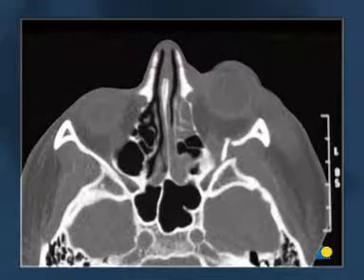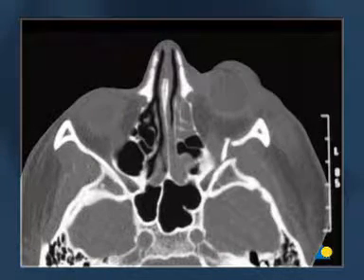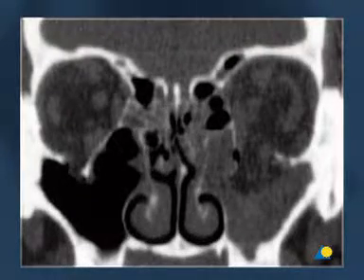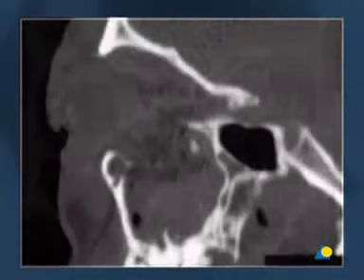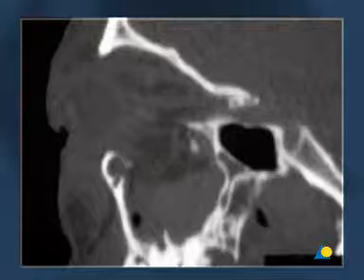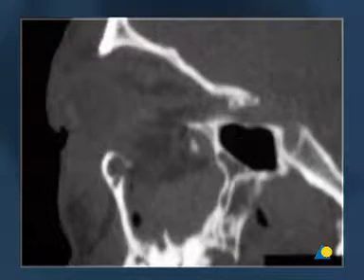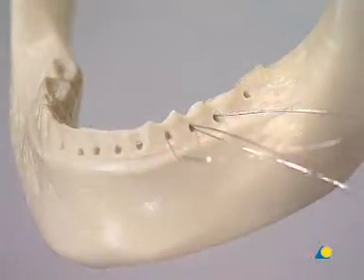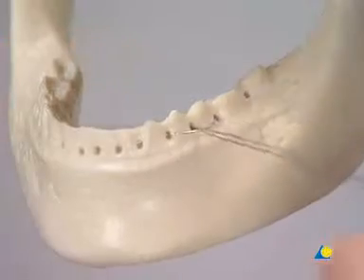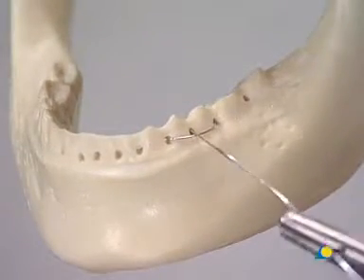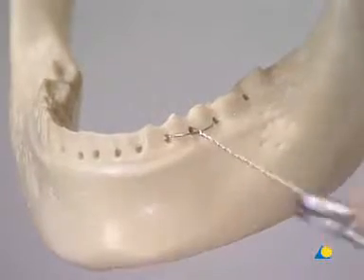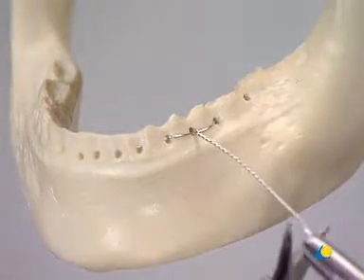The radiological diagnosis includes a CT in the axial, coronal, and ideally parasagittal plane, since LeFort fractures may be hard to identify using axial cuts alone. Depending on whether the mandible is intact or not, the MMF may be applied at various stages of the procedure. The mandible on this model is intact, so MMF using Ernst ligatures is placed first.